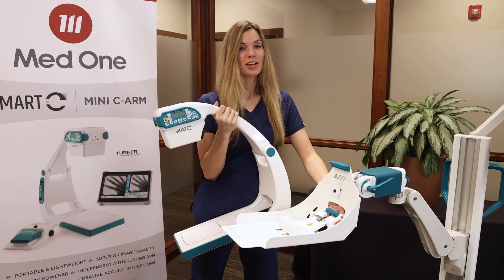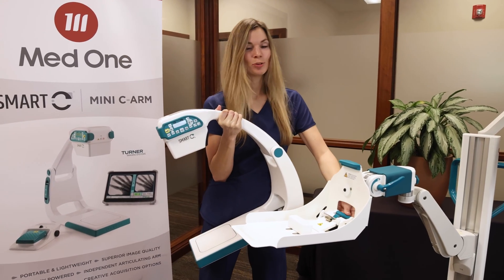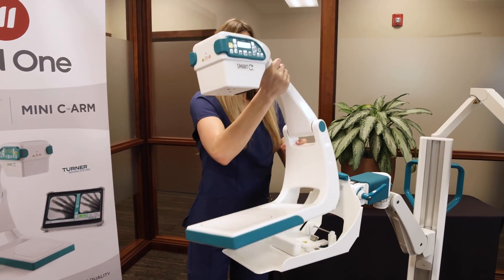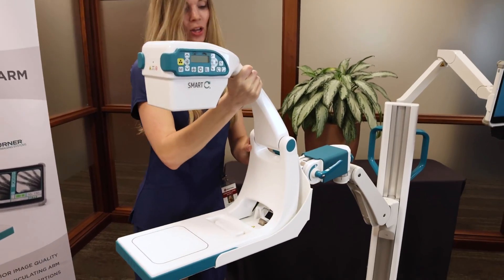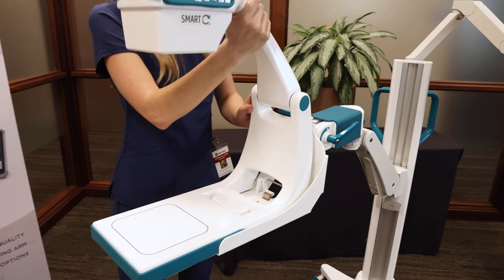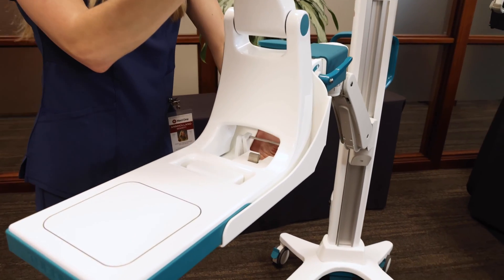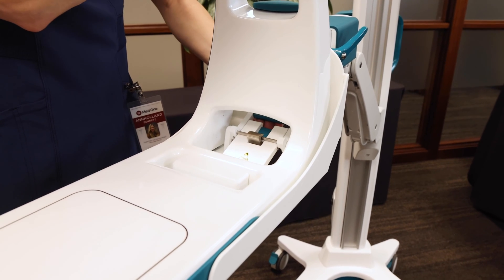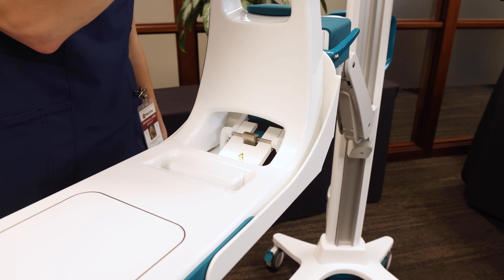To load the Smart-C, press the latch release and pull down on the handle to a fully open position. Load the Smart-C onto the tray, holding the neck with one arm to make sure it's secure. Use your other hand to lift up on the handle until it's fully closed and the safety latch is engaged.